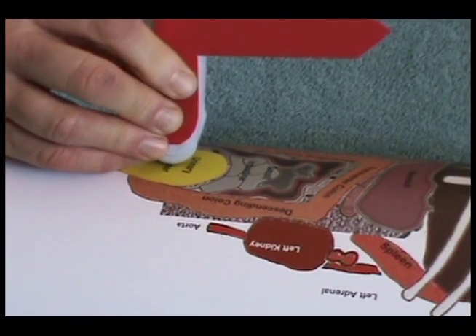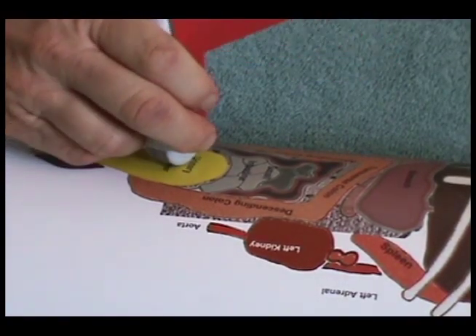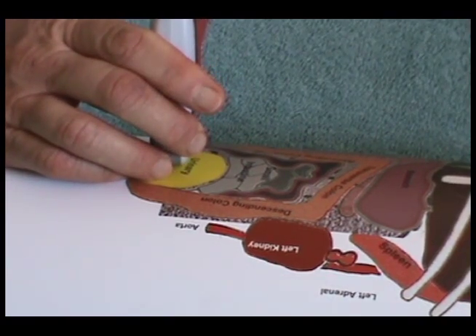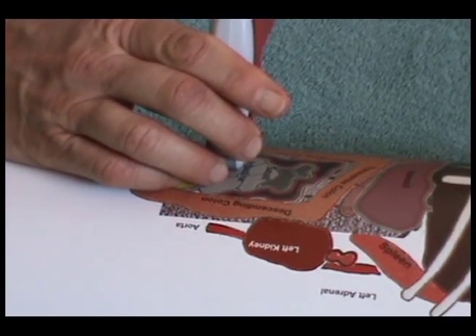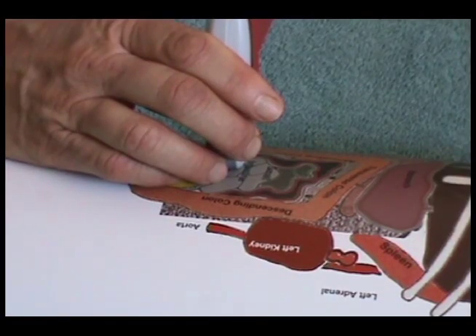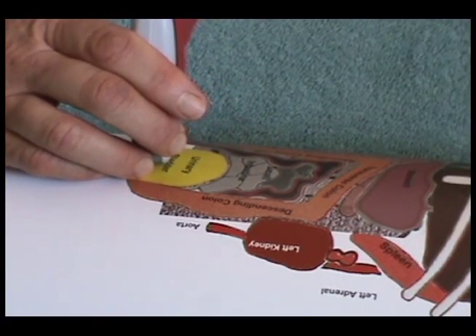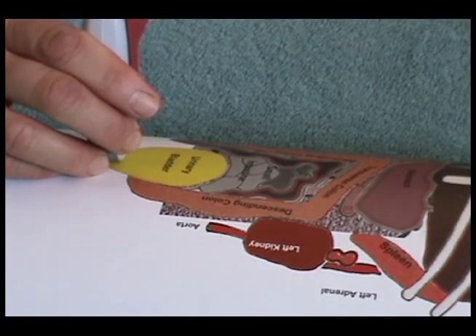Return to the ventral midline sagittal bladder and rotate the transducer 90 degrees counterclockwise to a transverse position. Slide rapidly cranially till the bladder is no longer under the transducer. Then slide slowly caudally till the caudal bladder is no longer under the transducer. Study the urinary bladder as you slide caudally.